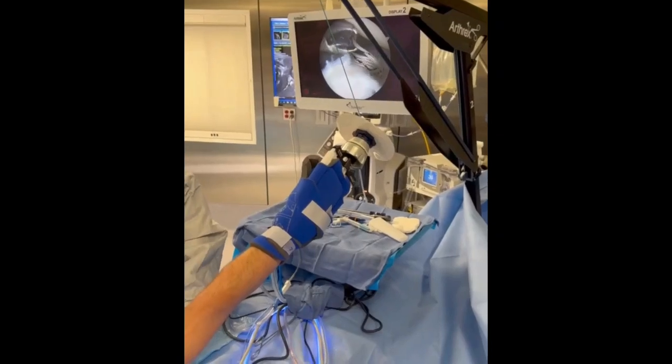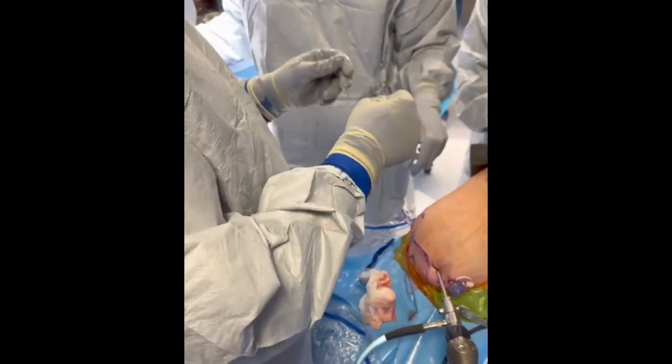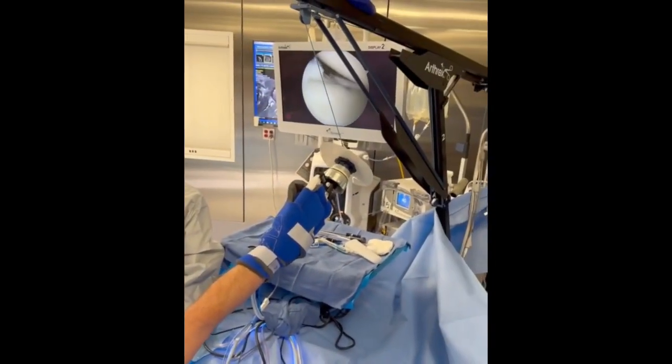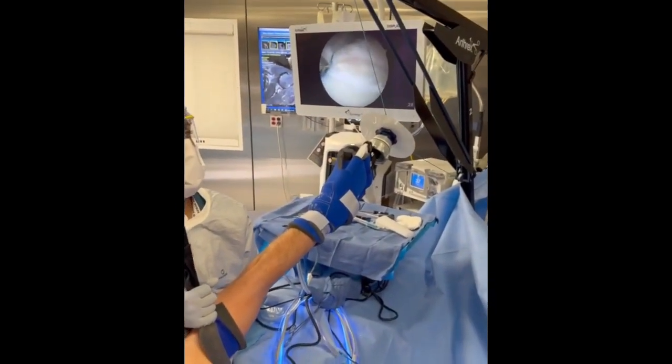A knotless repair is then performed using standard suture shuttle technique and tensioned appropriately. Once the knotless repair is adequately tensioned, the suture is retrieved through the posterior portal using a looped grasper and cut flush with the anchor. A standard layered closure is then performed.